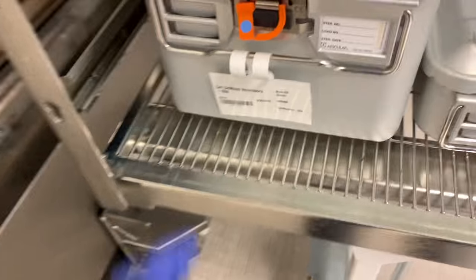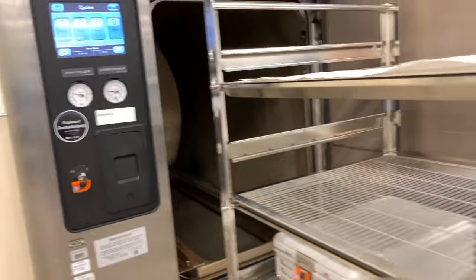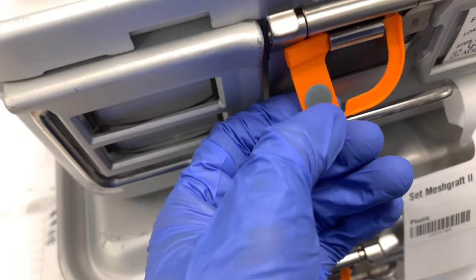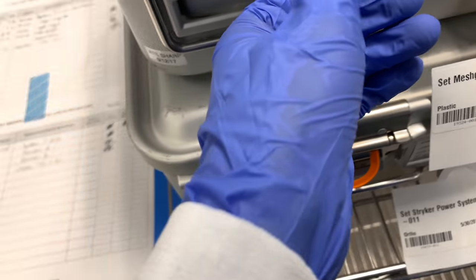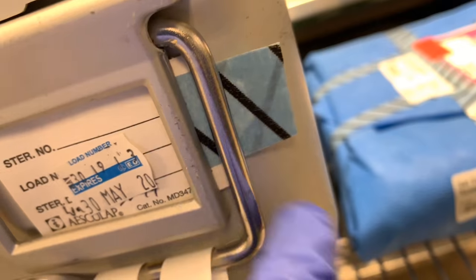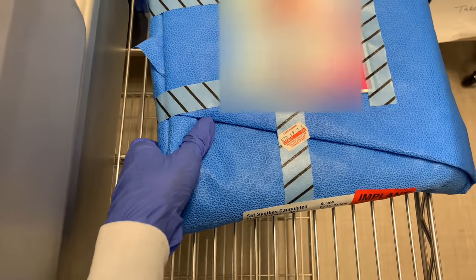All right, so these ones are ready for the sterilizer. When it's sterile, the blue is going to turn into a black color — that indicates that it's sterile, same with the tape. For things that are wrapped, it's going to show up as sterile on the tape.